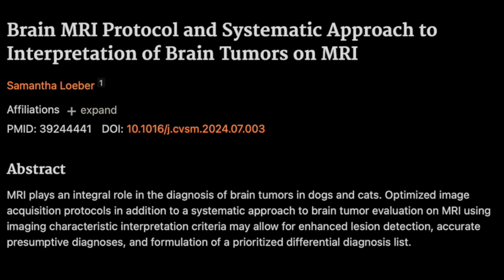Excellent question. The research really hammers home this idea of standardization. See, in human medicine, skull size and shape, they're pretty consistent. But in our world... We got Great Danes and Chihuahuas all in a day's work, right? Exactly. So comparing their brain scans, it's like comparing apples and, well, you get it. That's why having standardized QMRI protocols for animals, how we get the images, how we read them, that's crucial, especially if we're comparing different studies in patients. Makes total sense. Yeah. Standardized protocols, got it.